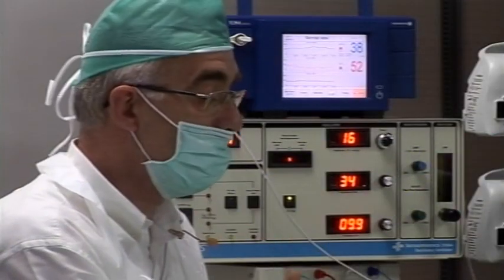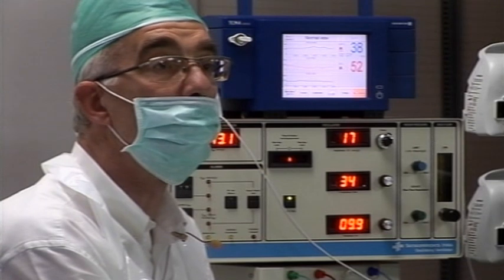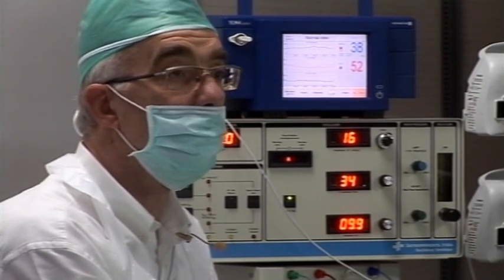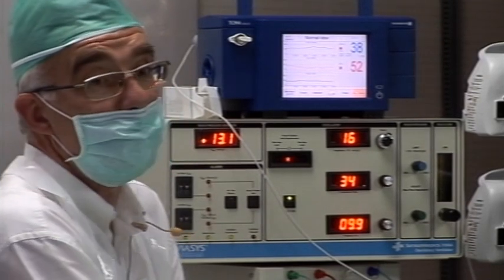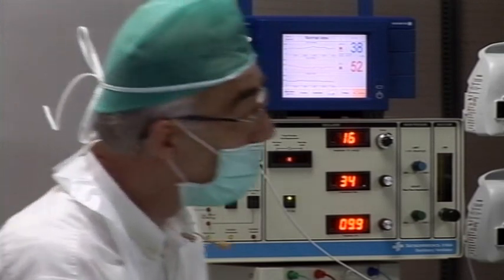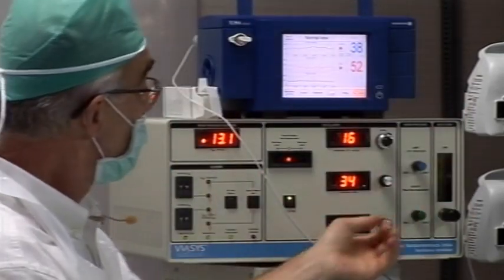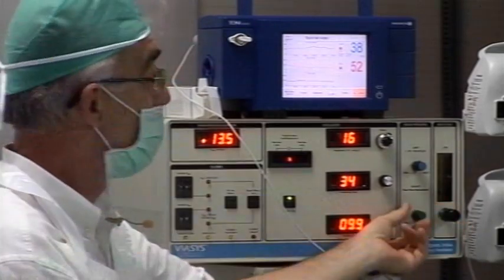They liked that better, but nasal CPAP is more nursing work. It's understandable, just like transcutaneous PO2 and PCO2. Lower the CDP. I'm sorry, I should turn this.